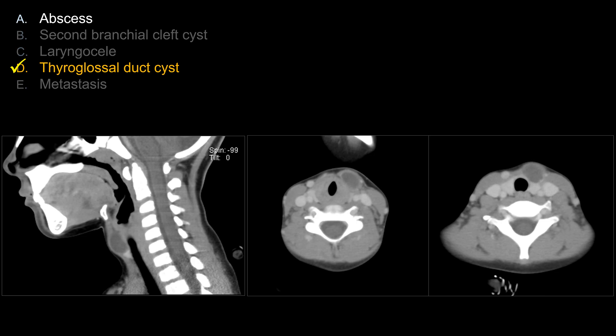Looking at the other choices: choice A, abscess — there is no rim enhancement at all, and the subcutaneous fat looks very clean with no sign of inflammation. Clinically, abscess does not fit. I would also consider metastasis less likely for the same reason — there's no rim enhancement or suspicious enhancing soft tissue component.